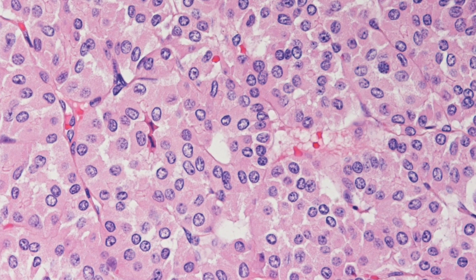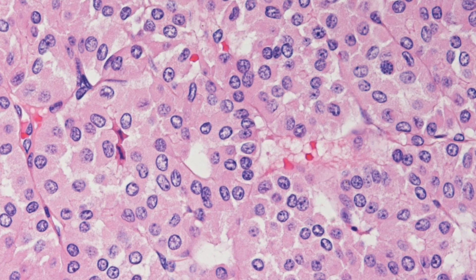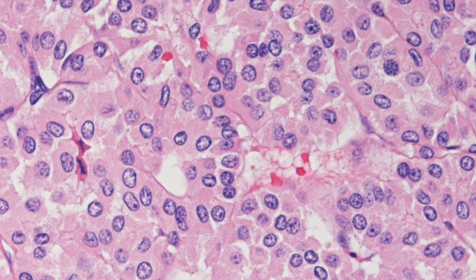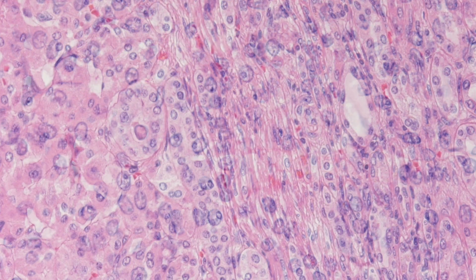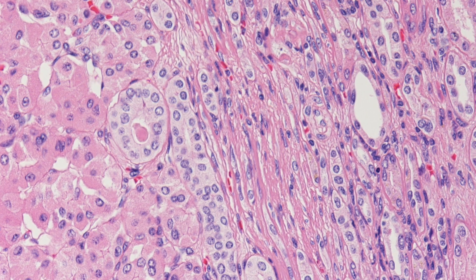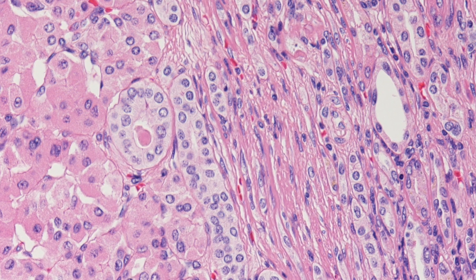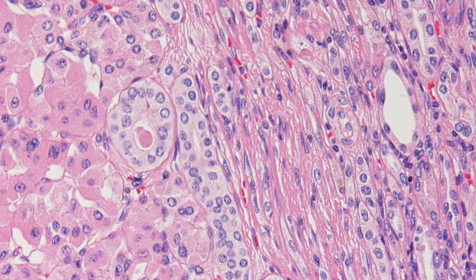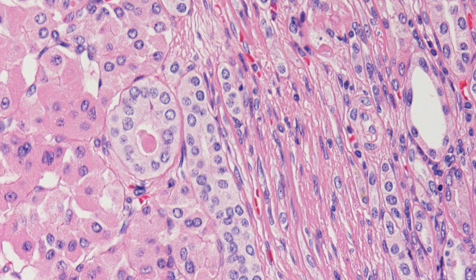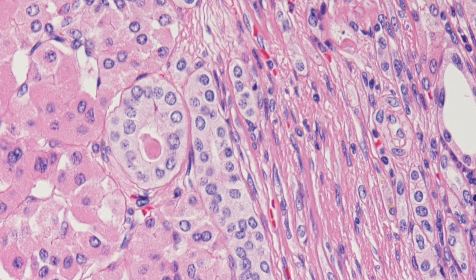On higher power the nuclei are seen to be regular with no mitotic activity. One feature I personally find quite useful in oncocytoma is that if you look at the edge of the tumour, it seems to merge rather imperceptibly with the tubules in the normal kidney.